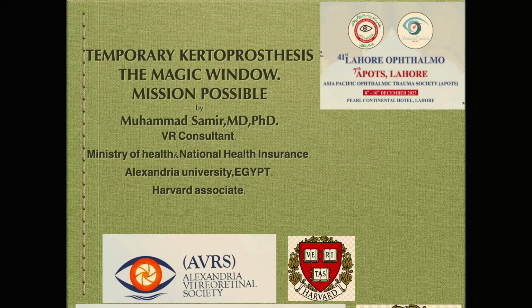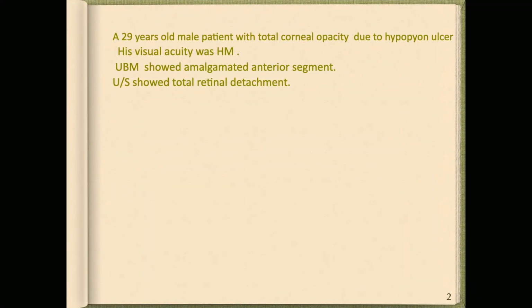I will speak today about three topics. My first topic is the K-Pro, the temporary K-Pro. As we see here, we sometimes are confronted with an opacified cornea and a retina problem.